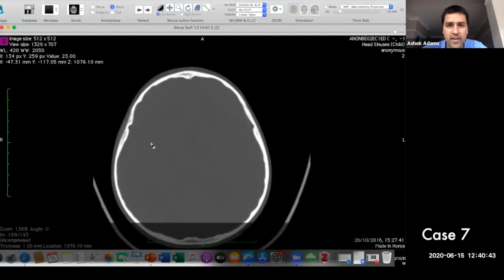All right, I've got a few more cases, but it's gone on for about 40 minutes. What I might do is just do one very final case. I'm happy to show when I've made mistakes myself. This was a child. This is just when you can get caught out as radiologists. This was a very final case.